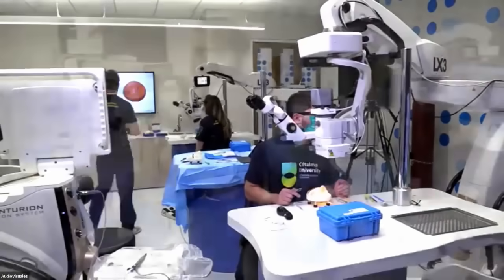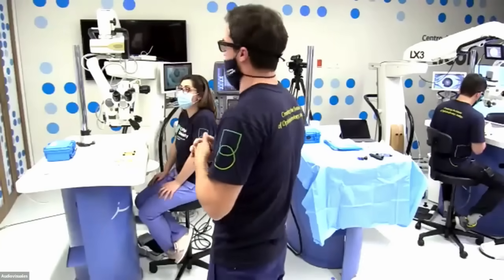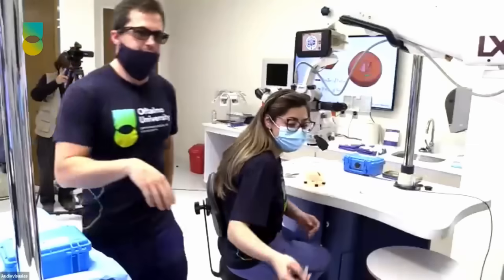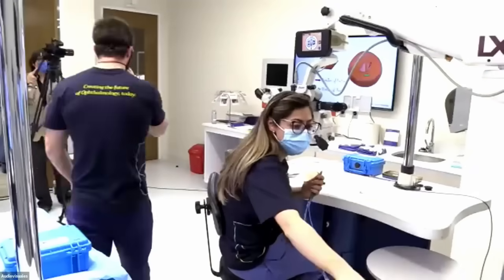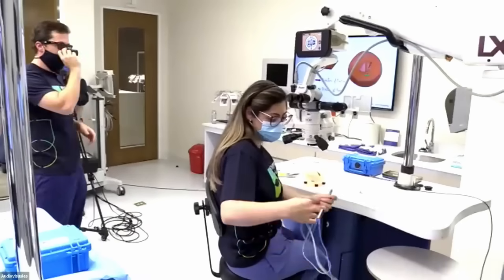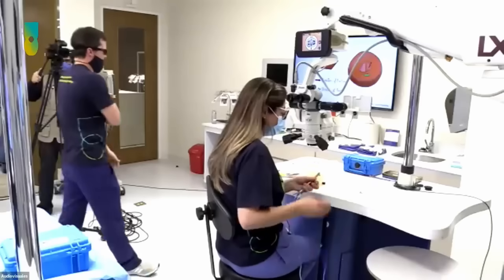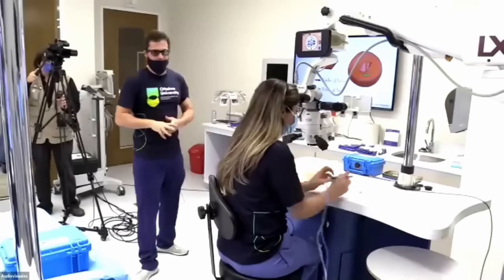Just for matters of time, we're going to do a couple of cases with those eyes with phacoemulsification. So please, you're going to start, Marcela. Start. Let's see if everything worked well. And actually, I put her on a Constellation machine, because it has a completely different pump, completely different behavior, but everybody needs to learn on different machines. So we're going to start doing some phacoemulsification.